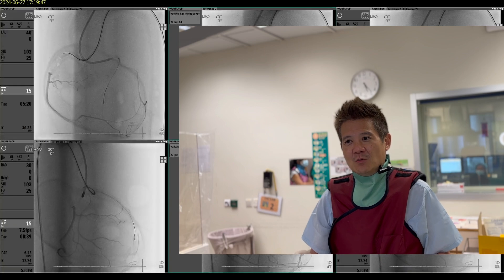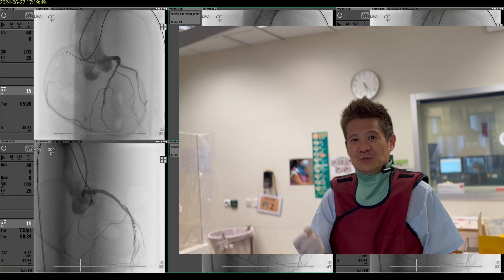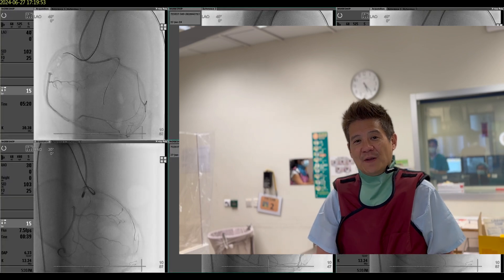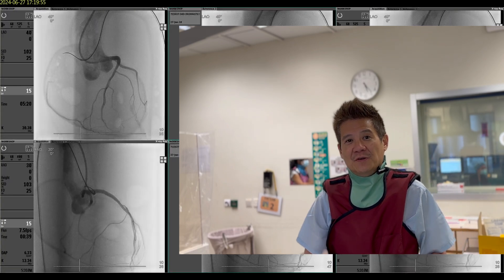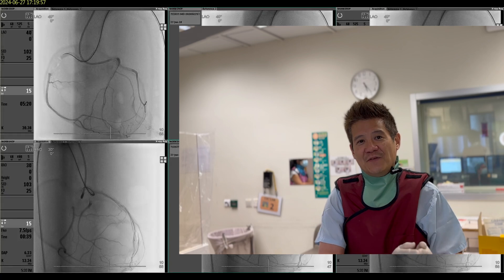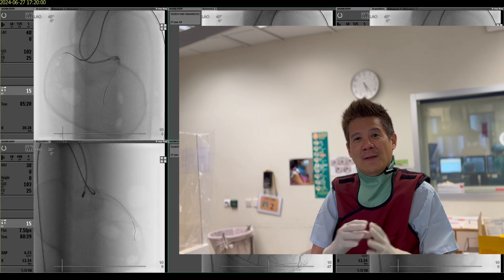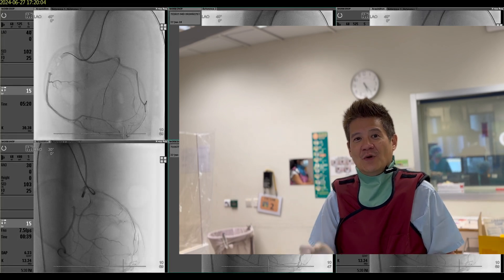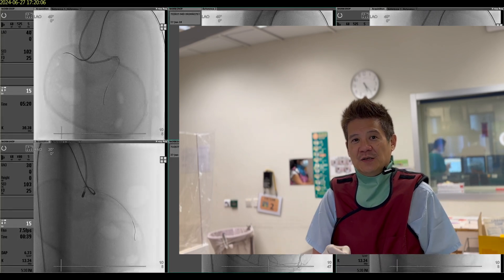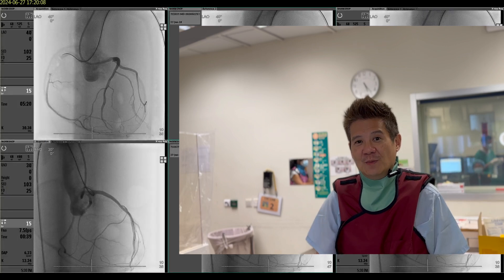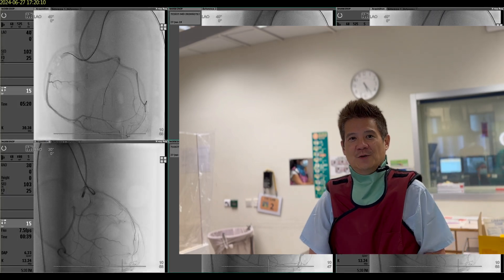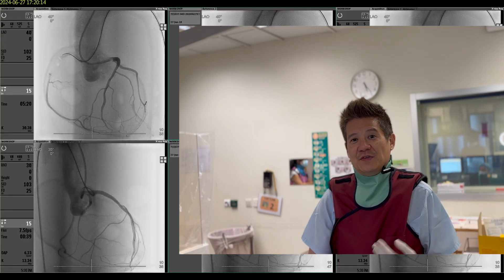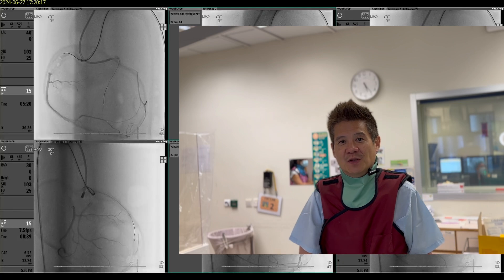Those of you who have seen some of my videos know that I developed this fluoroscopic 3D wiring method called ADAPT — Angiographic Three Dimension Anti-Grade Puncture Technique — ADAPT wiring. It's mainly used for puncturing from the distal CTO body into the distal true lumen; it's for distal cap puncture. Those of you who follow the channel will know and have seen the video on ADAPT wiring — see link in description below.